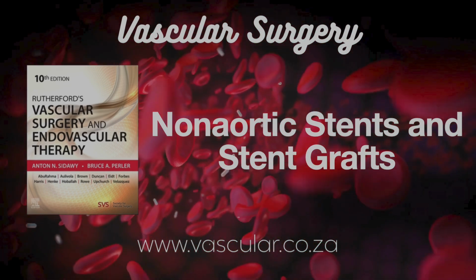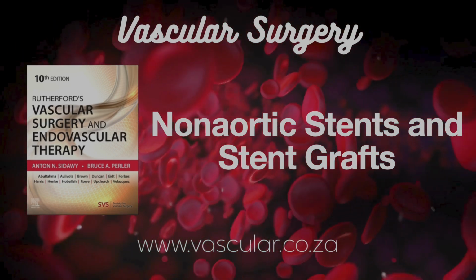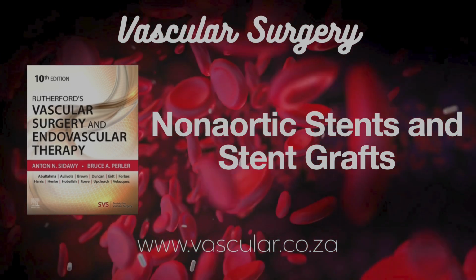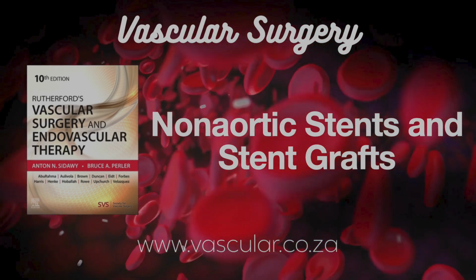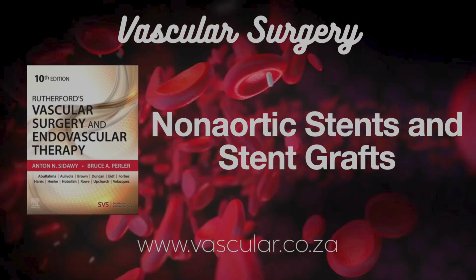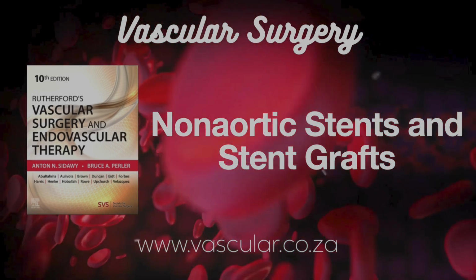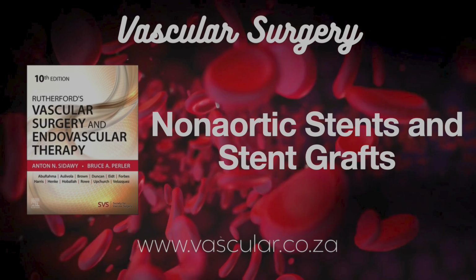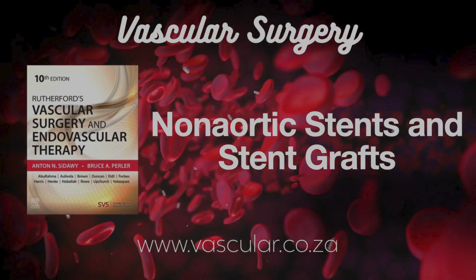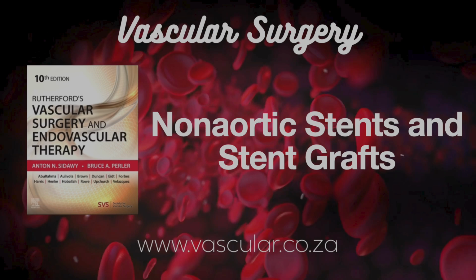Now, a common one in veins, May-Thurner syndrome, left iliac vein compression. Yeah, the right iliac artery squashes the left iliac vein against the spine, can cause swelling or clots. If you treat a clot and find this underlying compression, you usually treat it. With what? Typically a large diameter, oversized bare metal SE stent. You need the strong outward push, and oversizing helps anchor it. BE stents are generally avoided in veins, higher risk of poking a hole.